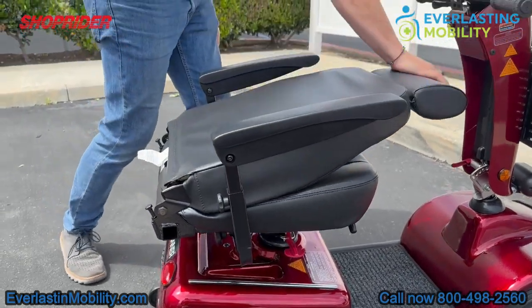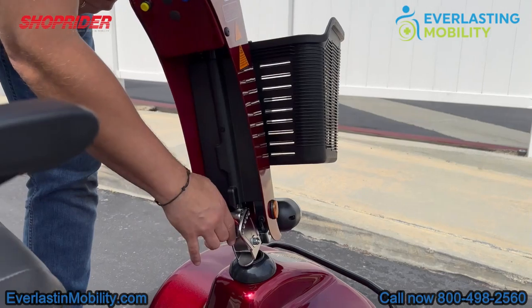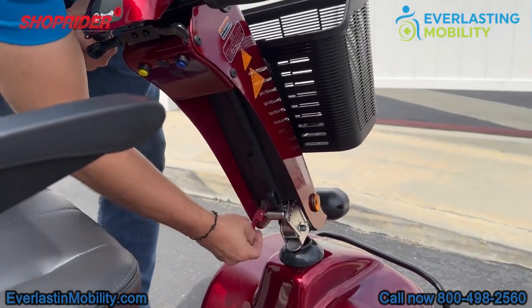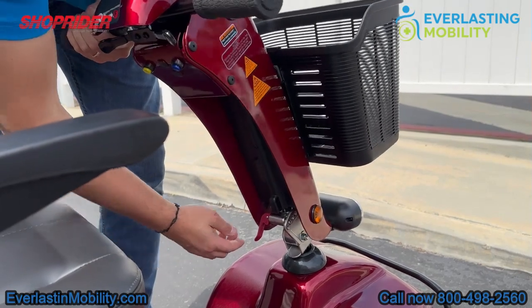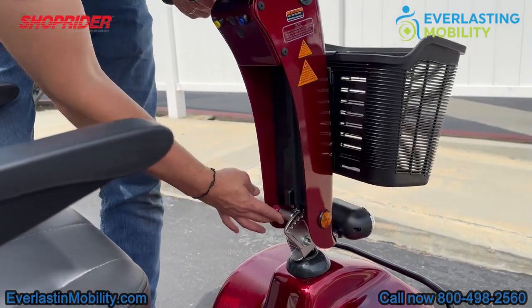The seat folds down flat, which is nice for transporting or storage. There is also a lever on the tiller that lets you adjust the tiller towards you or away from you, and once you reach a comfortable position, you lock it into place.